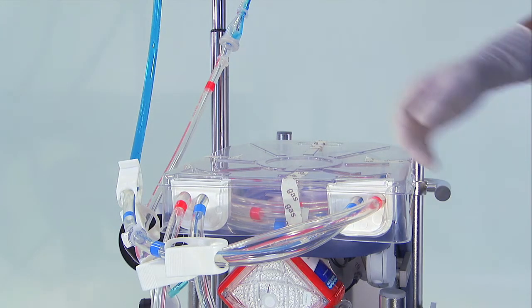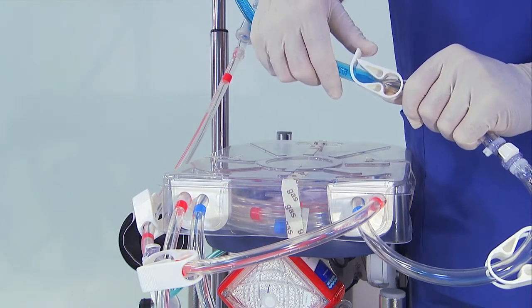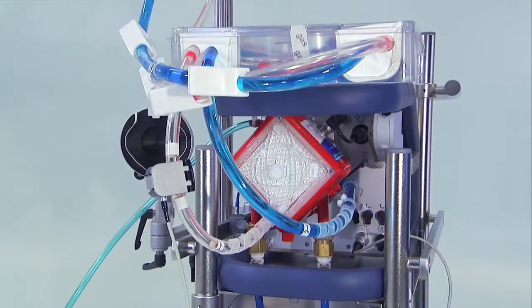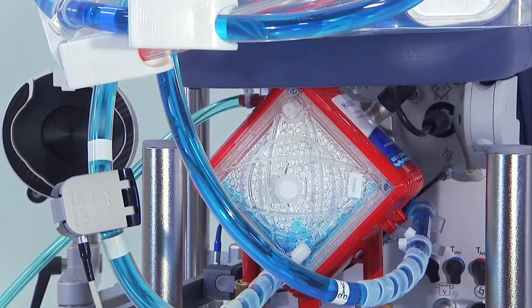Open the clamp on the blue line. Make sure that the clamp is fully open. Passively prime the set.